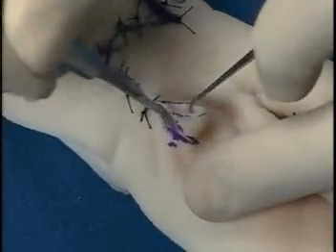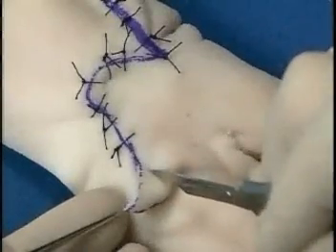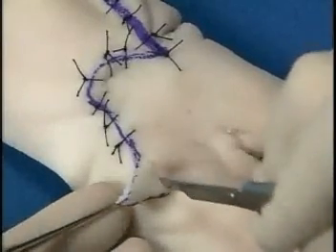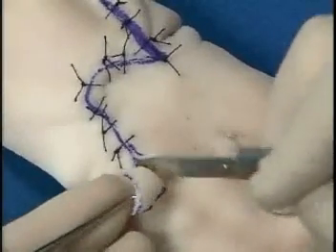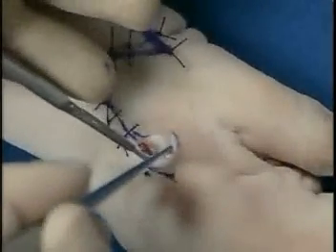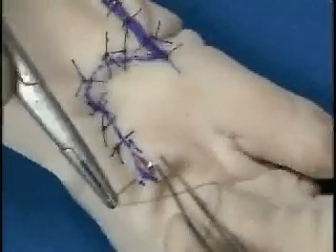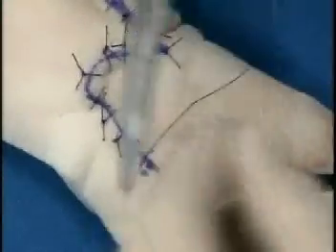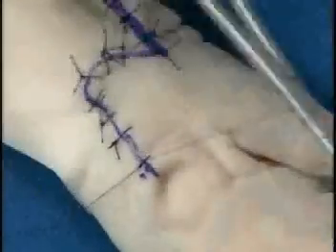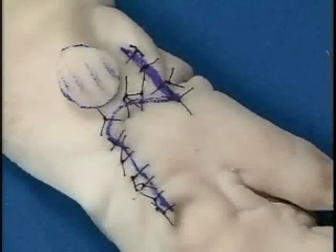We can see using the hook that we have excess, and this excess is now trimmed off, removing the dog ear and allowing the flap to inset nicely into the area of the defect. This is a relatively fast and easy technique to remove the dog ear. And now the sutures, one or two may be placed depending upon the amount of tissue that needs to be closed. The sutures are now placed to complete the closure of the wound. Here we see the excision of the circular defect and the closure with the note flap.